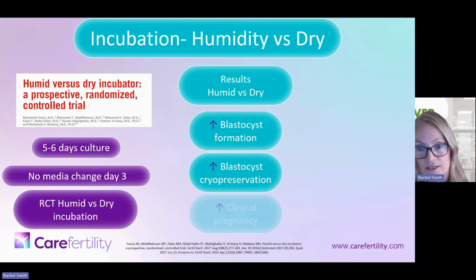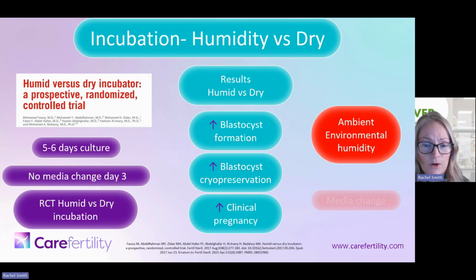There was increased blastocyst formation, increased blastocysts that were frozen, and an increase in clinical pregnancy rate when you were comparing a humid environment to a dry environment. At no point did they acknowledge the ambient environmental conditions to know what sort of level of humidity the dishes were exposed to, and they didn't perform a media change as part of this experiment.